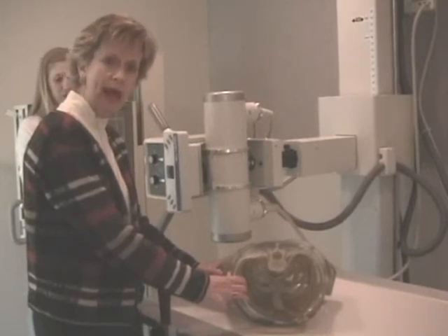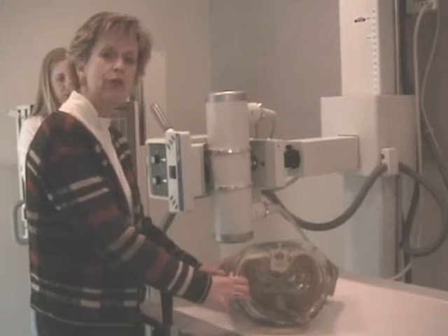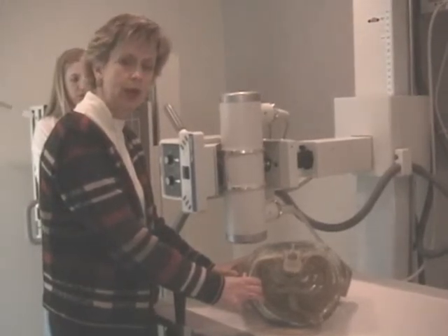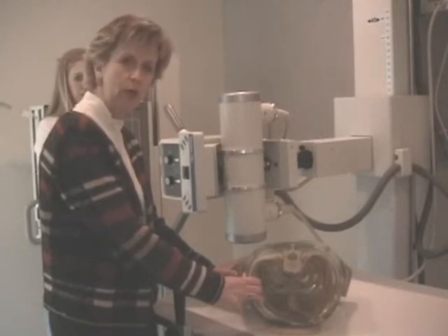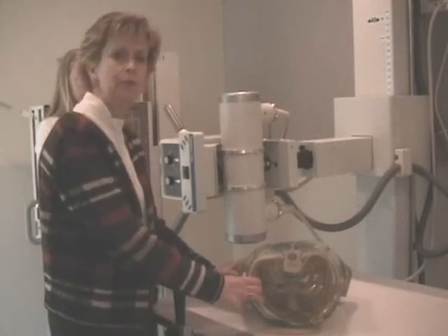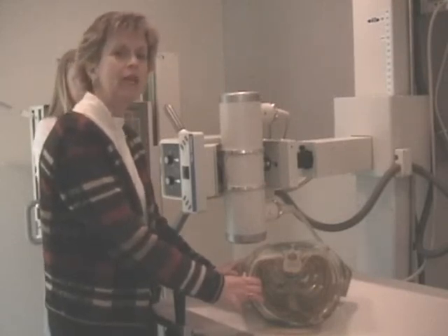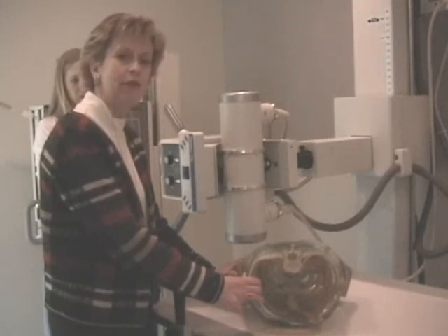And when the patient's back was next to the film, when you oblique the patient, you were after the downside. A right side injury, you did RPOs. A left side injury, you did LPOs. You were after the downside. Patient is now reversed. Okay? So if you were after the downside before, what side are you after now?